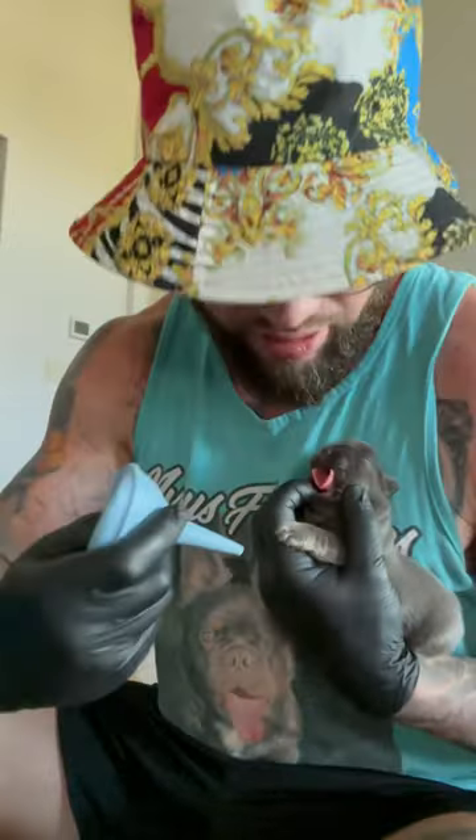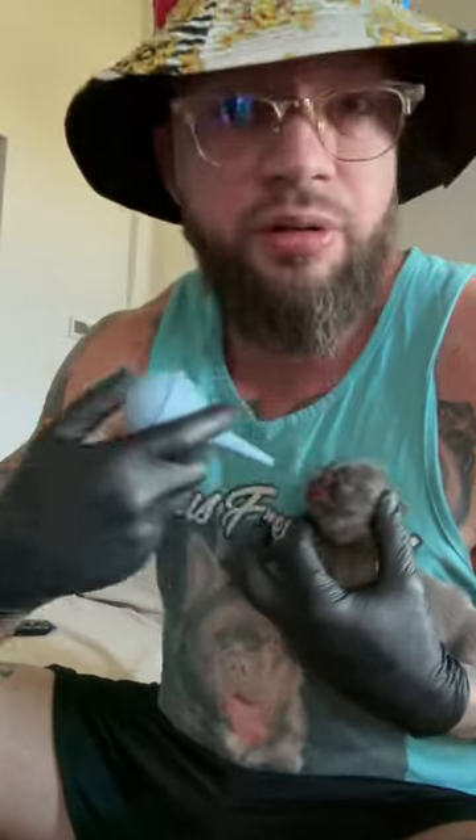Push in the nasal aspirator, open the mouth safely, go right to the back of the throat, and suction it just like that. Repeat this until the puppy sounds clear.